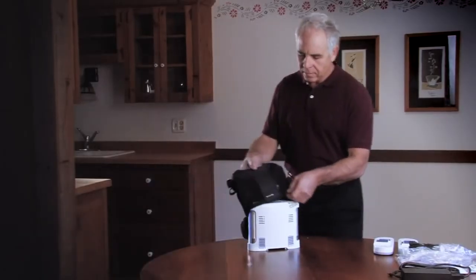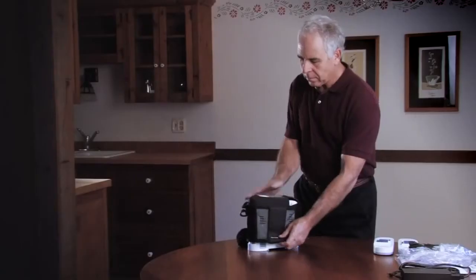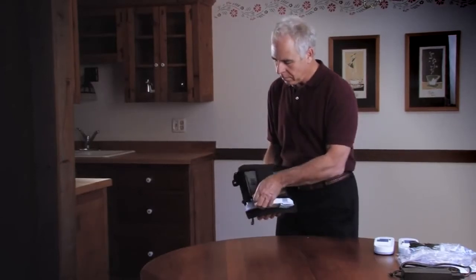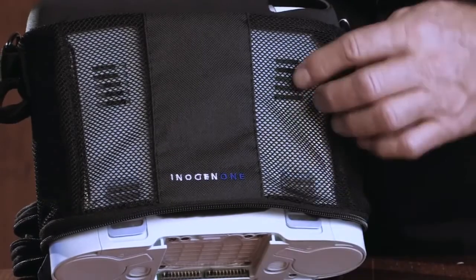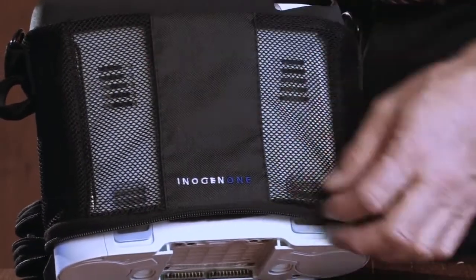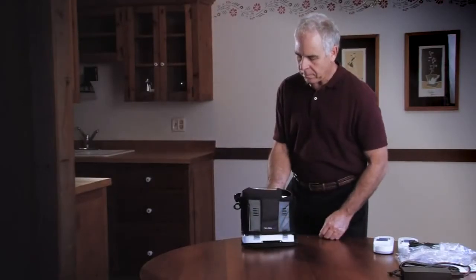Next, insert the G3 concentrator back inside the carry bag. To ensure you have placed the G3 concentrator properly into the carry bag, verify that you can see both air intake and exhaust vents through the mesh material of the bag. Do not zip up the carry bag yet.